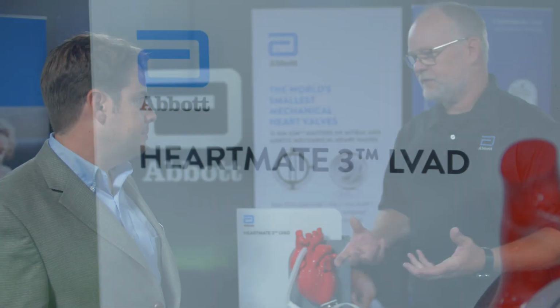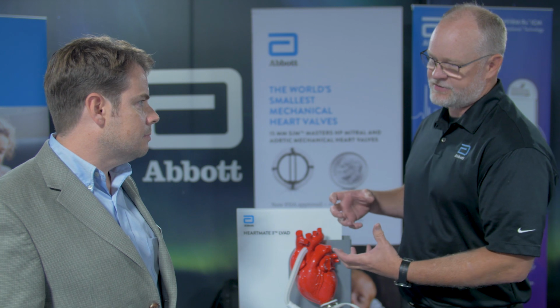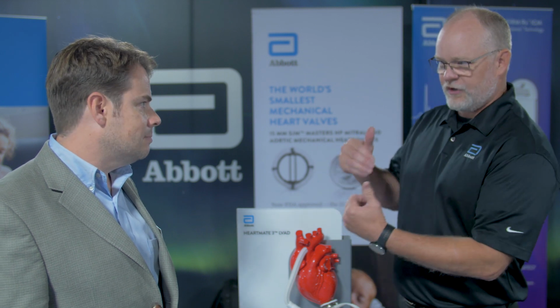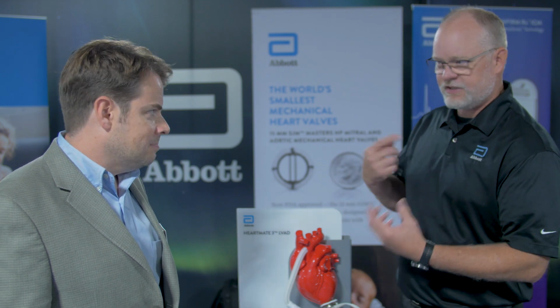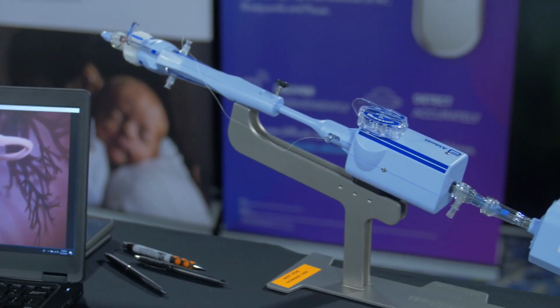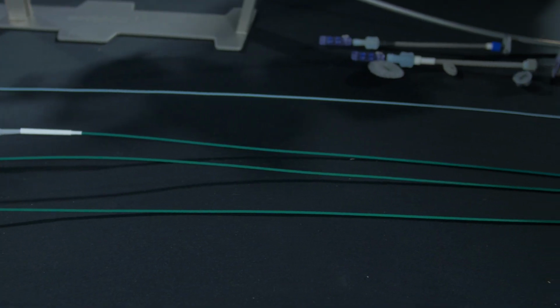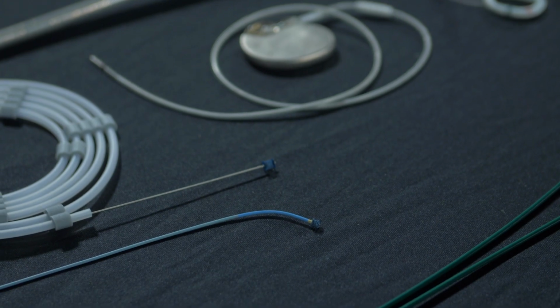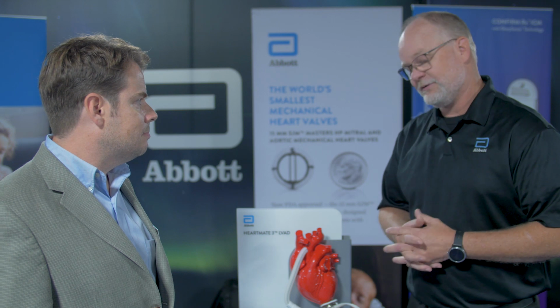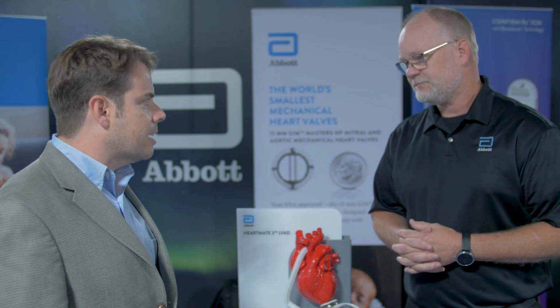The pump running and the gaps and everything there is to eliminate any of the stasis that might happen in some of the older pumps. So there's no blood that's sitting still. It's actually moving constantly. And with the motor control, you're actually starting to get pulsing too, so they can control that blood pulse with the motor. Oh, that's great. Yep, so you take some of the ventricle load off of the heart and it gives you a much better... People are hurting by the time they need this, so this is just a really good alternative. Sounds like a great improvement.